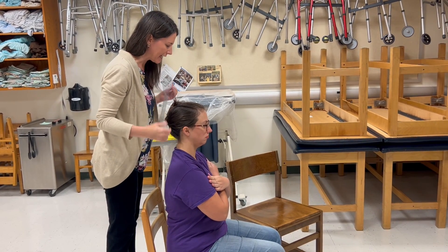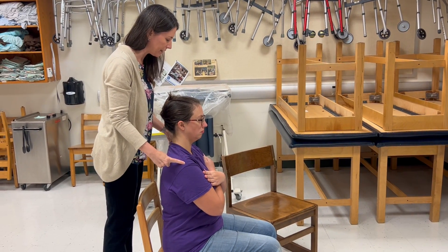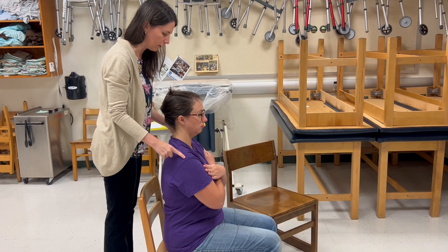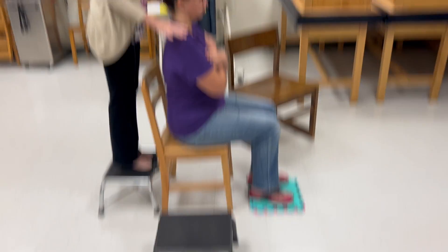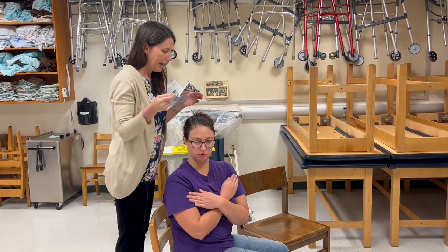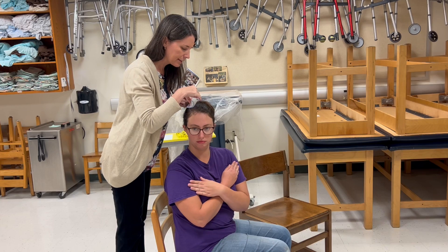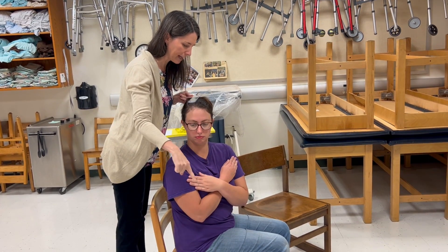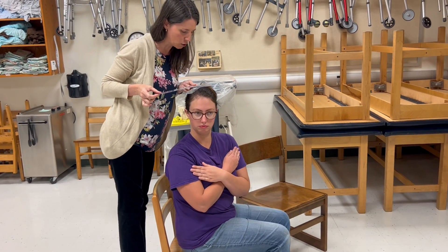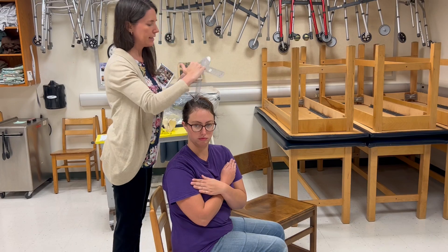When she rotates, that stationary line is going to move, so I compare the line connecting the two acromion processes to the lines on the floor — and luckily her acromion line is parallel with the black line on the floor, which won't move. When ready, I have her turn to the right as far as she can. I place the fulcrum directly over the center of the cranial aspect of her head, line the stationary arm parallel to the black line on the floor, and the moving arm aligns parallel to the line connecting the two acromion processes. That measurement is 0 to 39 degrees.